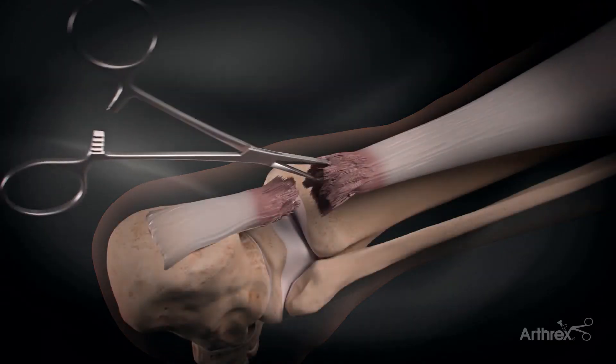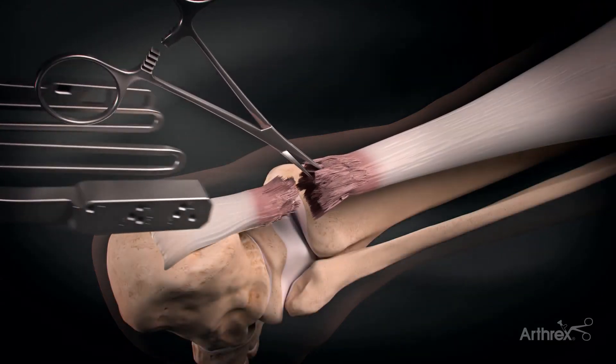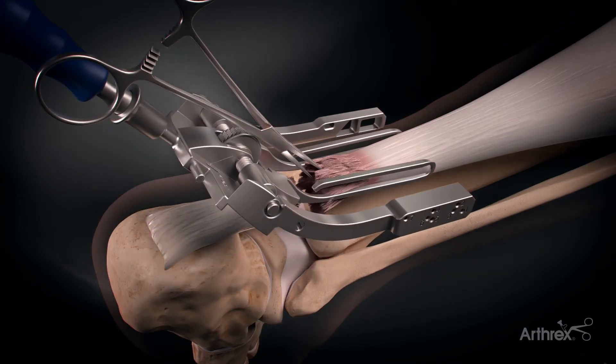As you can see in this video, the incision is made horizontally. However, I like to make mine more vertical, just in case you need to extend the incision.